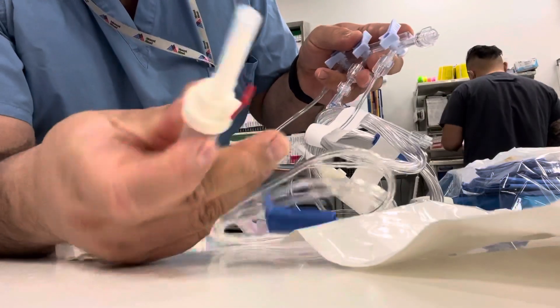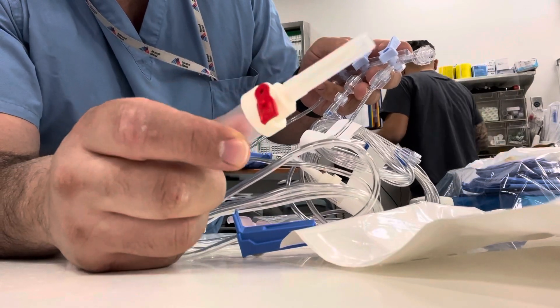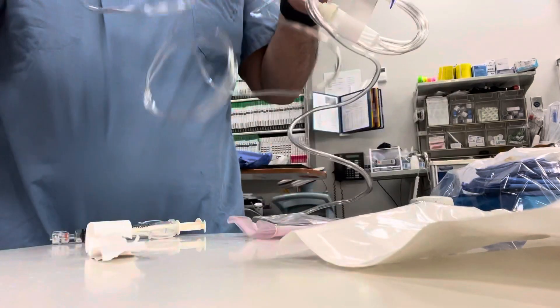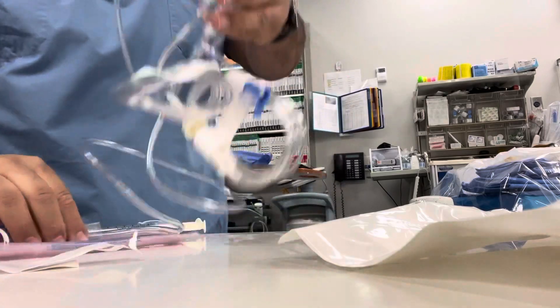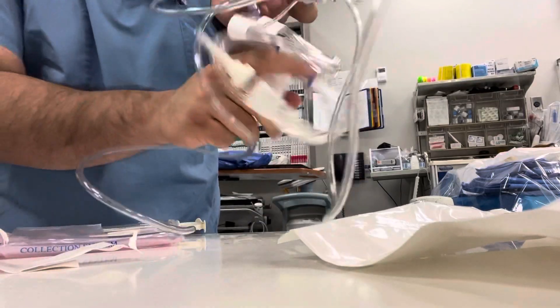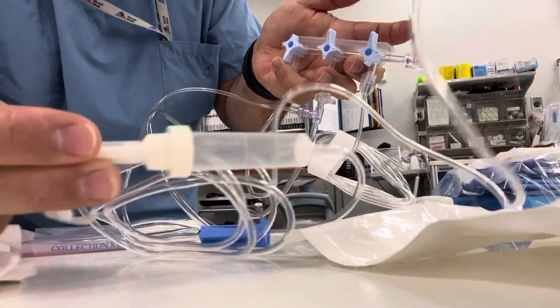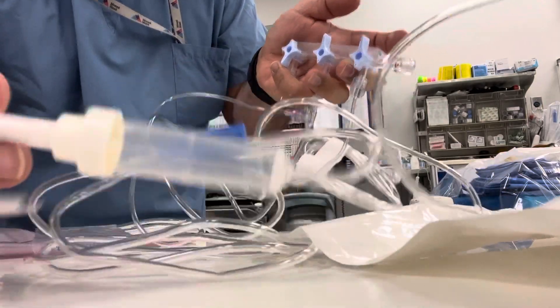Hand the red to the nurse or the other person helping you, to hook it up to the contrast. The blue goes to the second one — blue goes into the water, the saline.